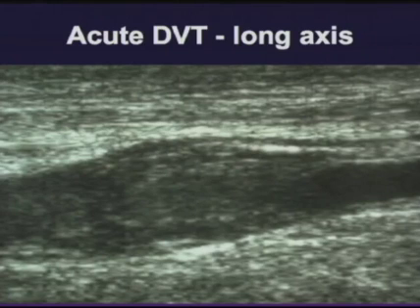Long-axis views can be helpful in that we can see the distension of the vein. Here at the caudal end of the picture, the vein is small, and you can see that it distends quite dramatically in the middle and at the cephalad end, and there is thrombus all the way through above this cephalad component. In addition, I want to point out the echogenicity of the thrombus.